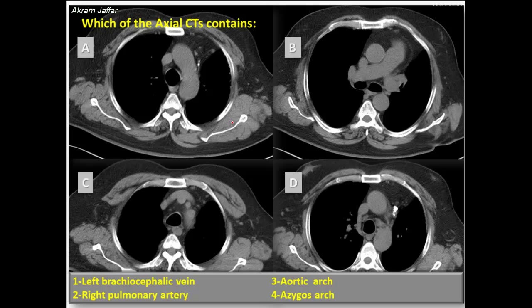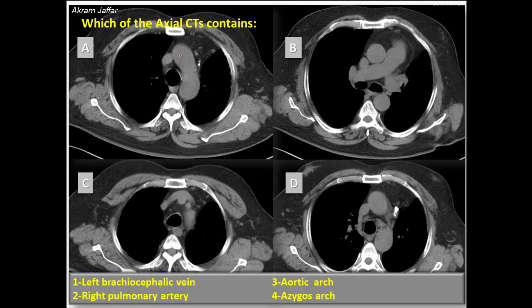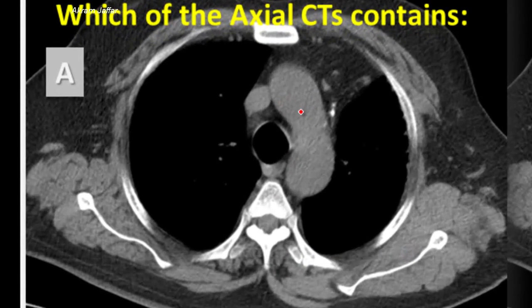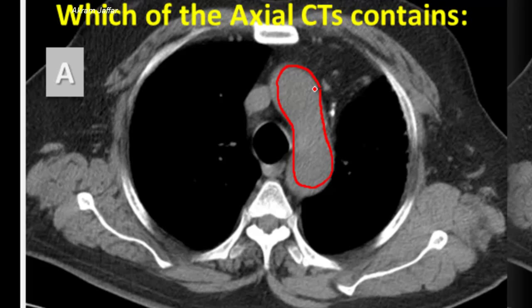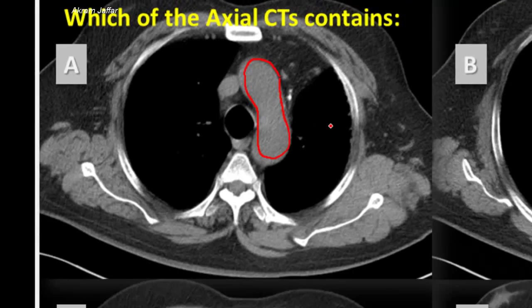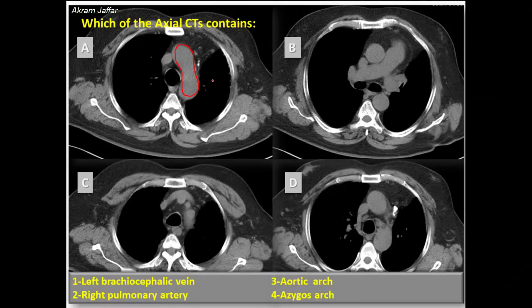These are axial CTs. Let's look at the axial CT in A. Here we can see that there is an arch-like structure, and this is located on the left side, and it is produced by the arch of the aorta. So the aortic arch matches with A.